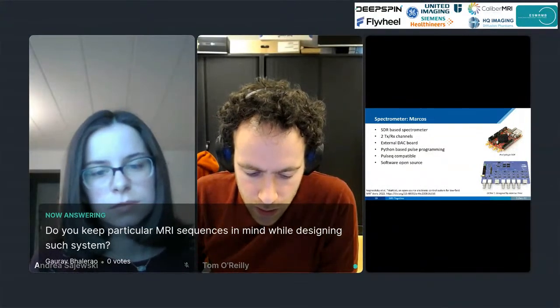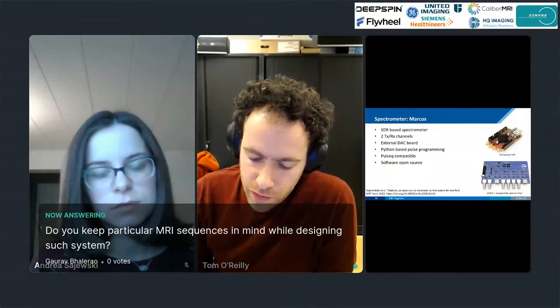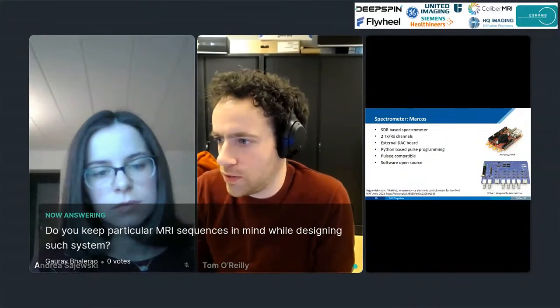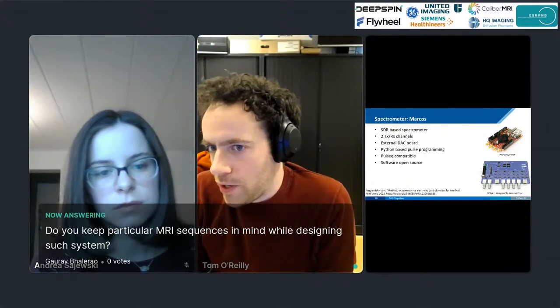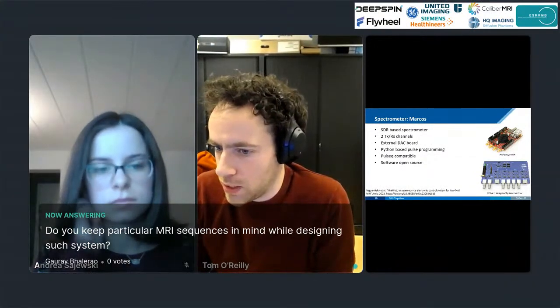And then you have to ask the question, what's the difference in system performance that I get for a system that has 50 ppm versus a system that has 500 ppm? Can I actually run different sequences on that system? And the answer is very often no, you can't, because the spin echo sequence makes you very, very robust to B0 inhomogeneities.